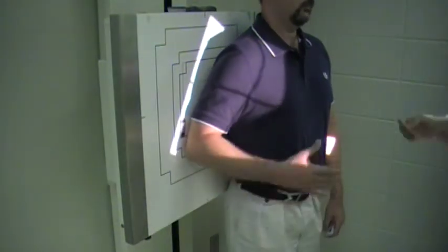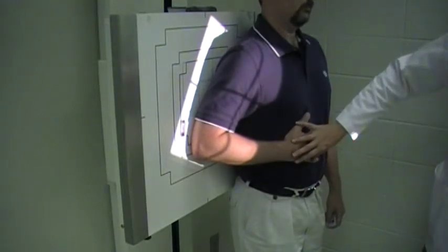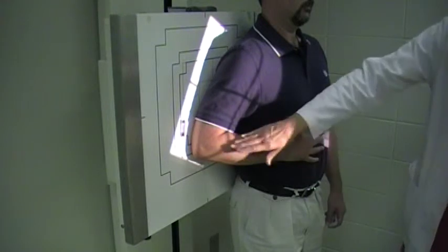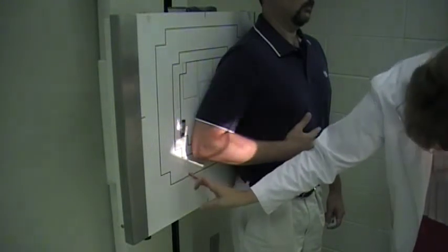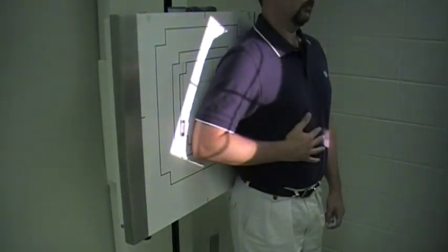For the lateral, you can bend the arm so that the hand is resting on the abdomen. Your central ray is still going to be at the mid-humerus, but you want to double check and make sure you do see a shadow of the elbow and the shoulder on there, because you do want both joints on the humerus.